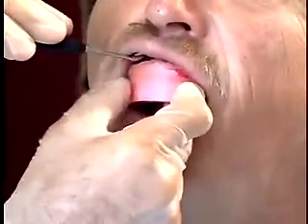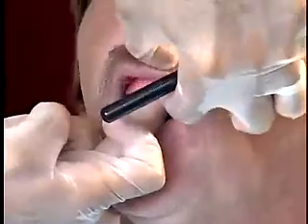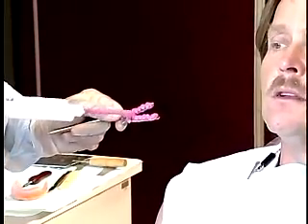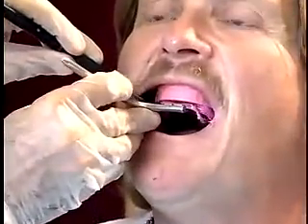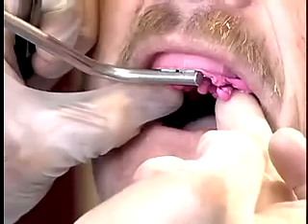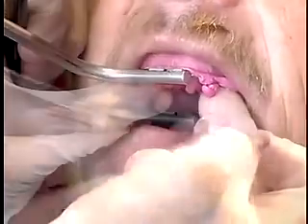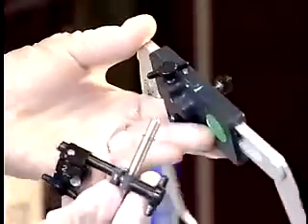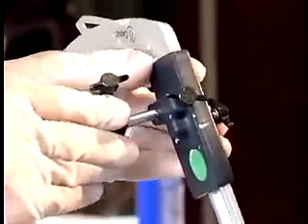Place the maxillary record base in the patient's mouth. Place a small amount of bite registration material on the facebow fork, then place it in the patient's mouth. Wait until the registration material is set, then ask the patient to hold the maxillary record base in place with his or her fingers. Assemble the facebow apparatus following the manufacturer instructions and make the facebow transfer record.